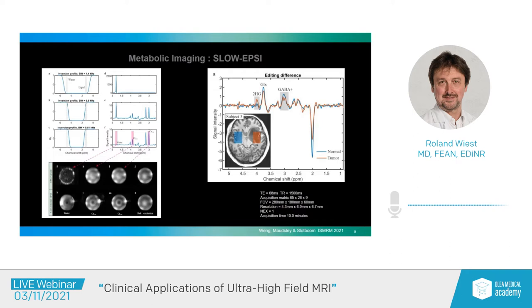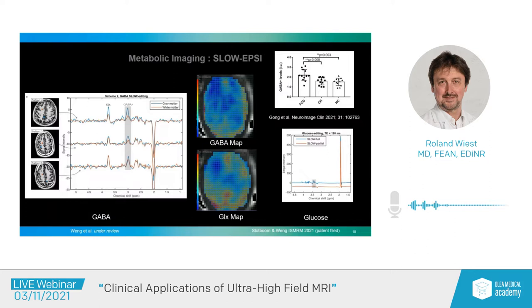So first, I would briefly touch on the advantage of having GABA spectra within the repertoire of the clinical MR. Here in the middle of this image, you can see the GABA map and the glutamate map in a patient with a brain tumor, and you can easily see that the areas where the brain tumor is show a decrease in the GABA.